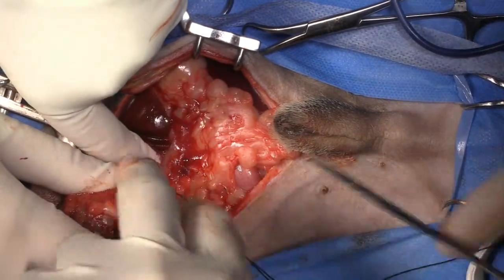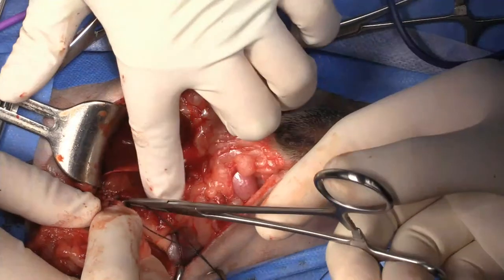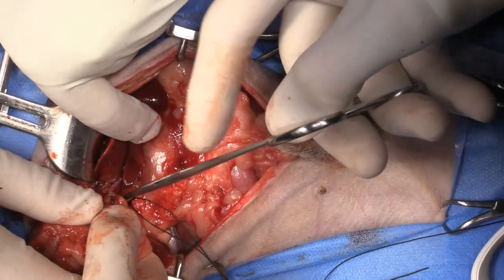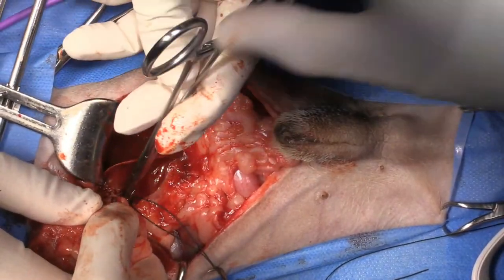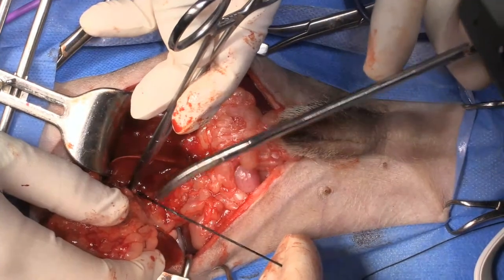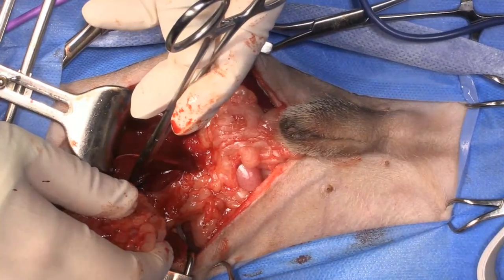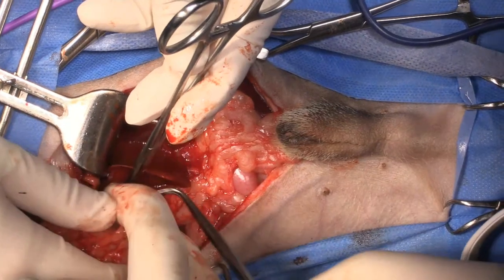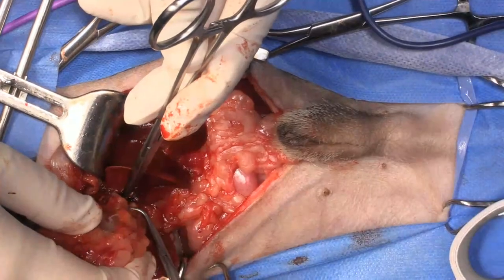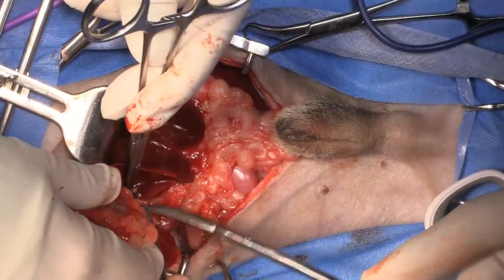And let me just make sure that I haven't torn through the wall. Just got the neck again, just to make sure I haven't lost it. And I'll cut that ligature. Get another right angle. Do I have another right angle handy? Okay, and then I'm going to come on top of that. And then we'll get some suction ready. I'm cutting the neck of the gallbladder here.